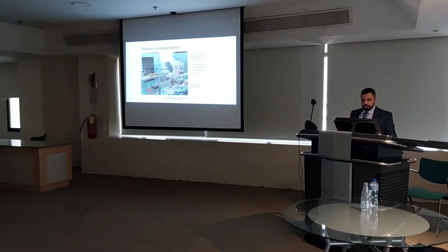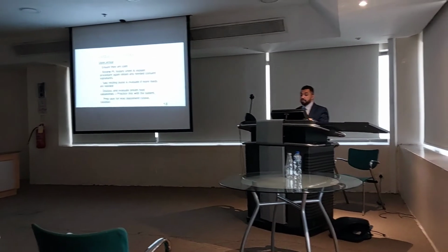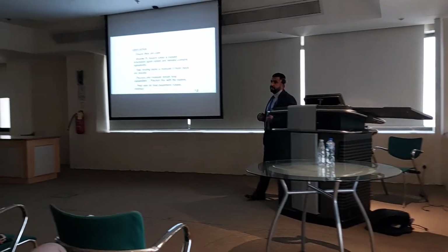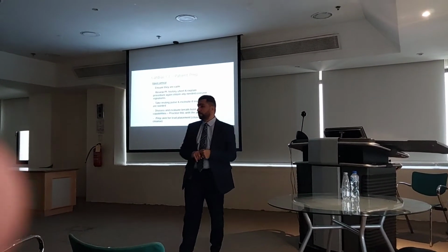Now, after we let the patient discuss a little bit about the breath-hold within the scan, the quality of the ECG signal is very important. So I will prepare this.